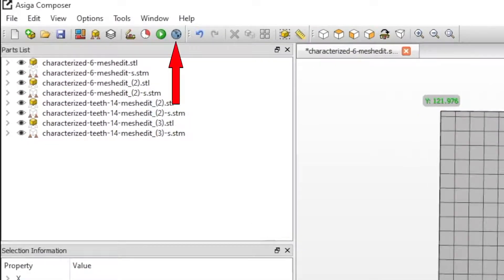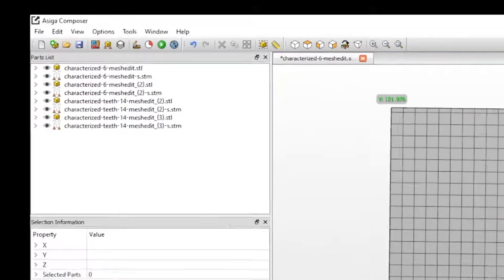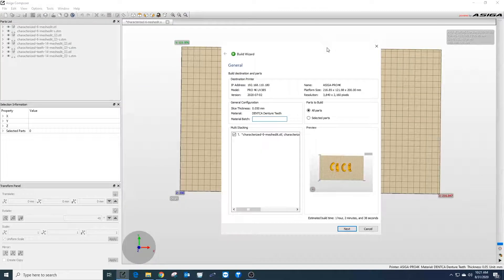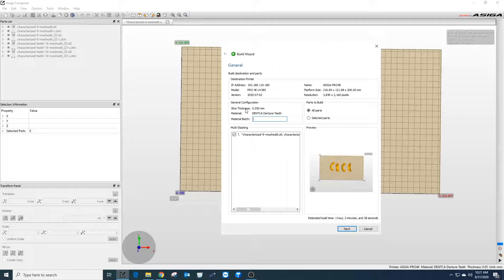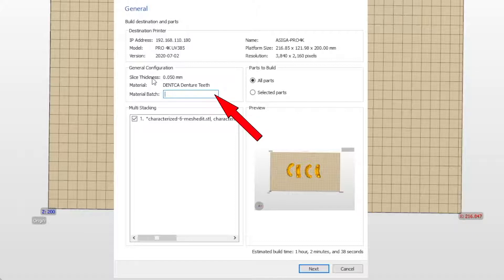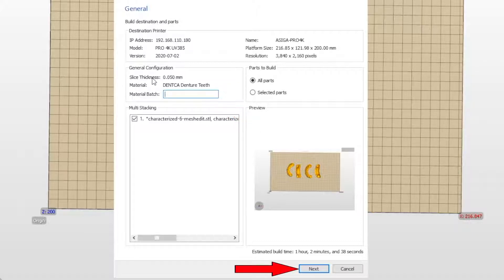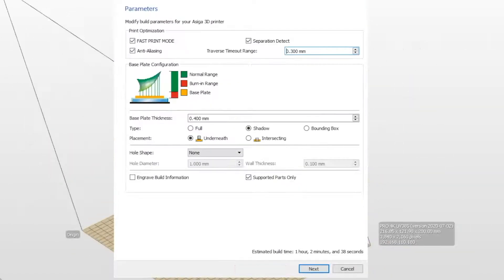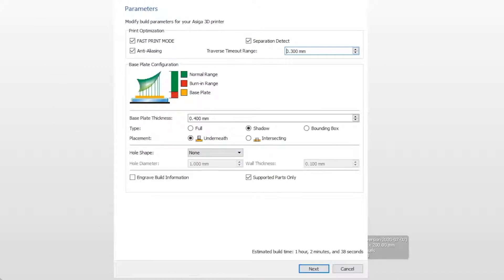Click the build icon in the menu bar. The build wizard window will open. The first window is an outline of the print job parameters and the material being used, along with a place to add a lot number if needed. Click next.